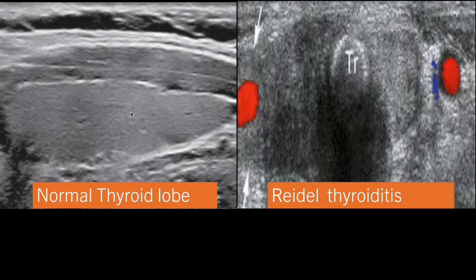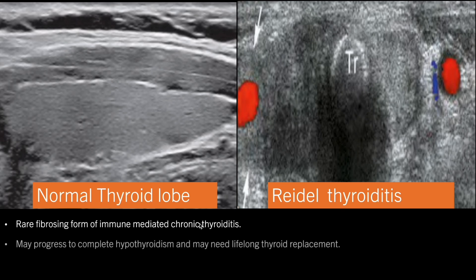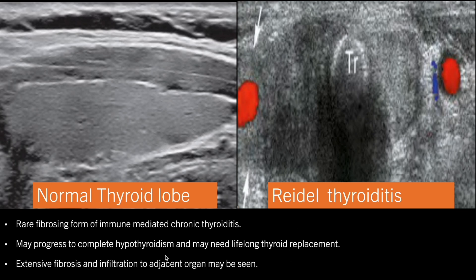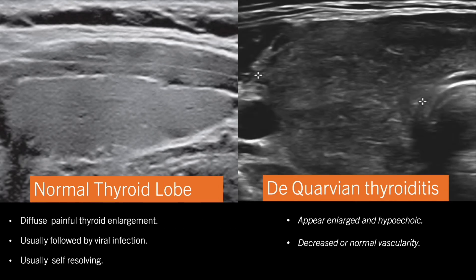Another important cause of diffuse thyroid enlargement is Riedel's thyroiditis. On ultrasonography, we can see this is the normal thyroid lobe compared to Riedel's thyroiditis. The trachea is the midline structure, with the left and right thyroid lobes on either side. Riedel's thyroiditis is a rare fibrosing form of immune-mediated chronic thyroiditis; it may progress to complete hypothyroidism requiring long-term thyroid replacement. Extensive fibrosis and infiltration to adjacent organs may be seen — in this image, the right thyroid lobe has infiltrated the carotid vessels.